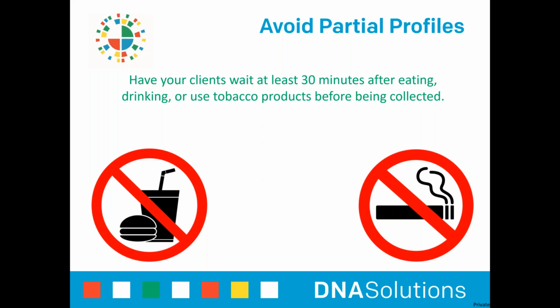Eating or using tobacco products could interfere with testing and prevent the laboratory from obtaining a full comparable profile. Clients should wait a minimum of 30 minutes after partaking in any of these activities before having their mouths swabbed. Those 30 minutes can easily pass by while completing chain of custody forms, sample envelopes, and processing payment. So be sure to ask these questions at the beginning of a collection appointment to save yourself some time.